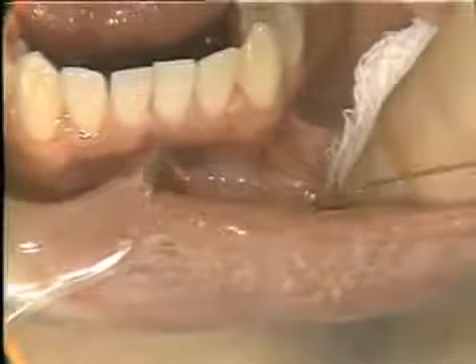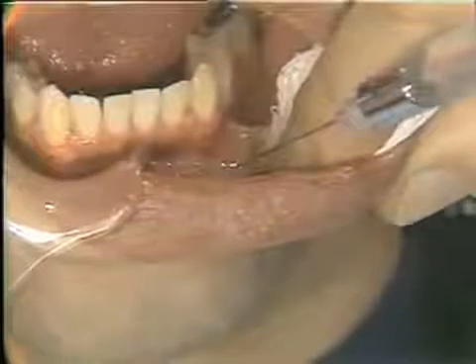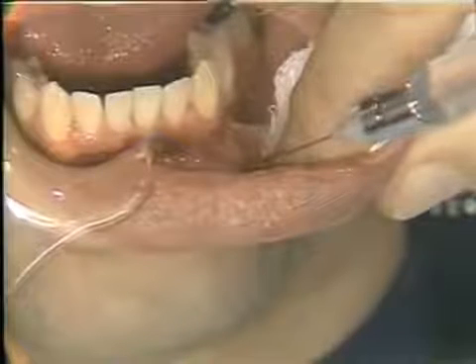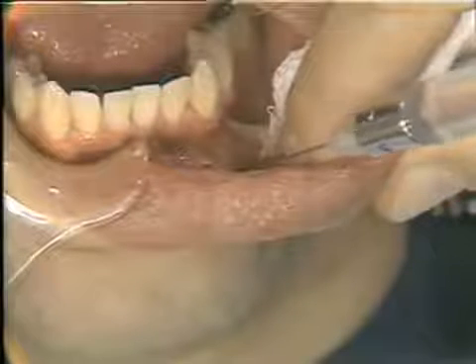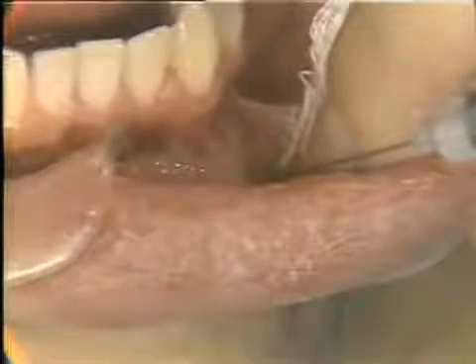Needle puncture out in the vestibule at about this angle, and then carried right through to bone at a level of or below the apex of the cuspid tooth. And remember again, it's a little longer than the other incisors. All right, this we have accomplished. I'm going to aspirate a little bit. We get no blood back in the syringe. We know we're in a safe position. And remember again that any time the needle bevel is against bone, you can lean on it a little bit. This will elicit no discomfort whatsoever. And very slowly we'll inject approximately a cc and a half of solution.